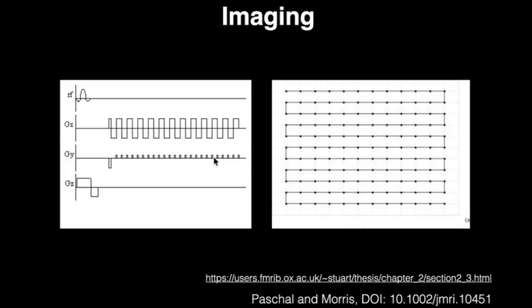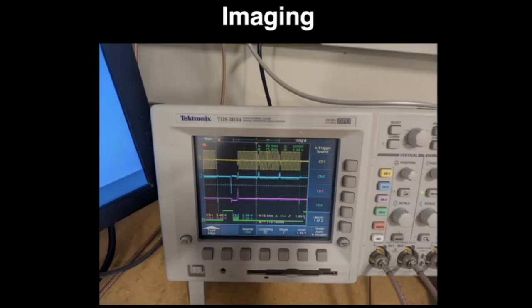But on a real system, which I just acquired a couple days ago, this is acquiring a 3mm 3 echo EPI scan. Between the end of the previous image and this one here, that takes about 80 milliseconds. Okay. In a 2-second TR, it's 25 slices. So that's not a lot for what people expect from our systems.